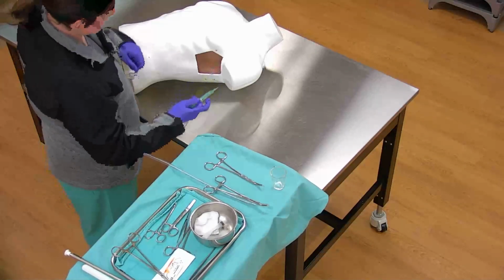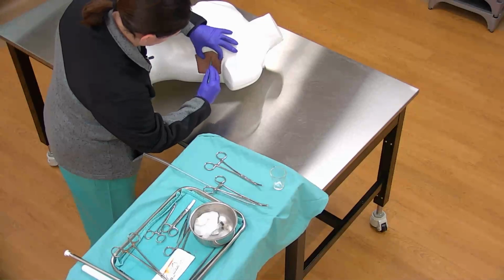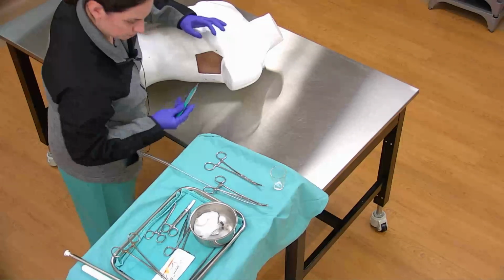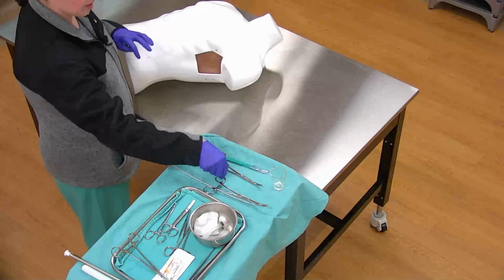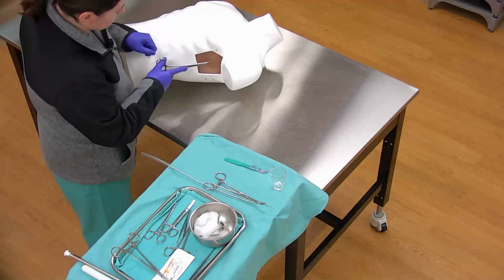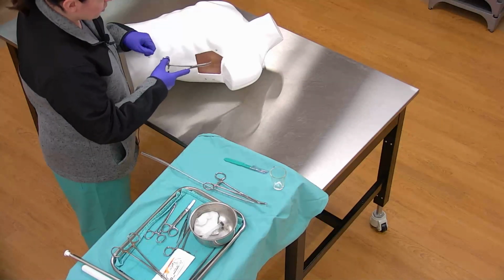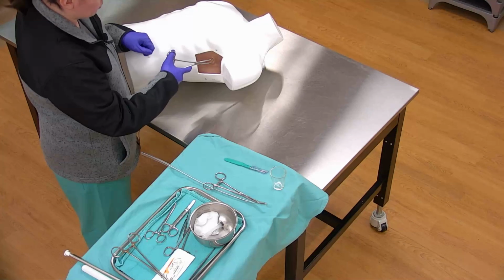I begin by making my incision. I feel for the rib, and I place my incision directly over the top of it. Then I take my dissecting instrument, and I spread through the tissues on top of the rib, dissecting just over the top of the rib.